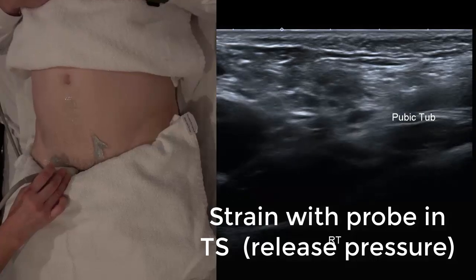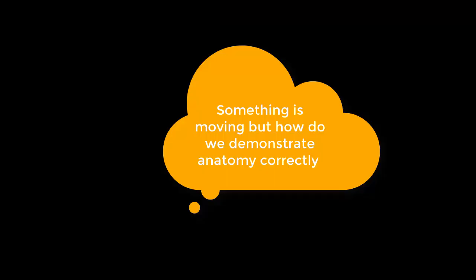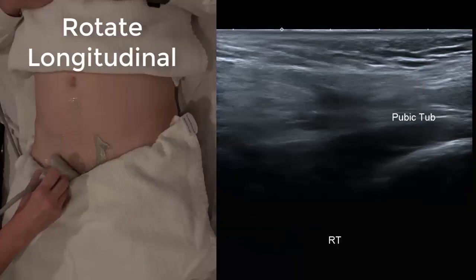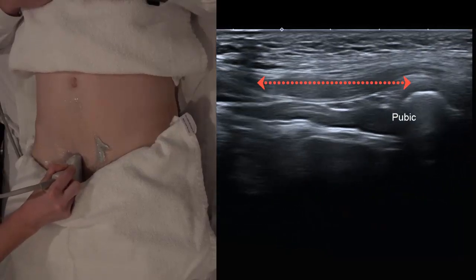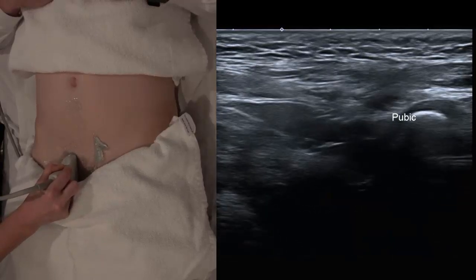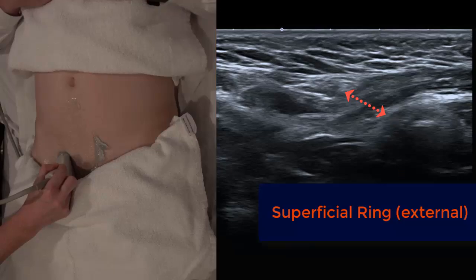We can ask the patient to strain, but remember you need to take the pressure off the probe to allow the hernia out. You can see something's moving but at this point we still don't know if it's direct or indirect. Running down in longitudinal on the rectus abdominis or the pyramidalis muscle, we follow the peritoneum and pyramidalis and arrive at the pubic tubercle. Move slightly laterally and identify veins in the spermatic cord — this is the superficial ring. Now rotate the top of the probe slightly obliquely to point towards the ASIS, aligning with the inguinal ligament.